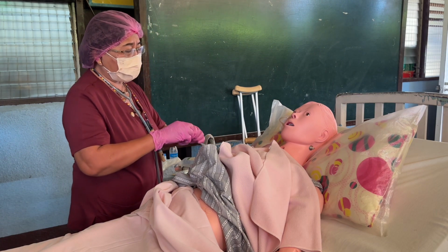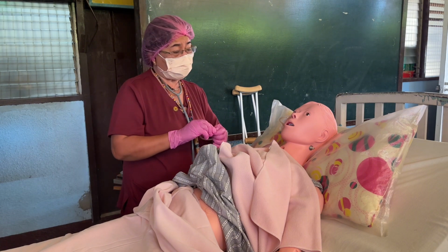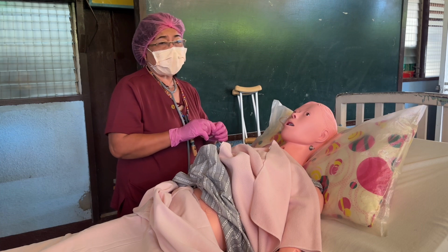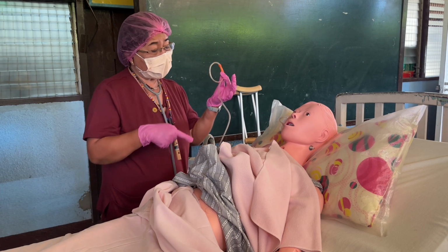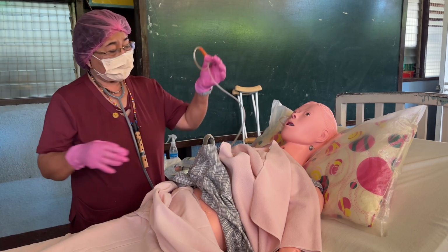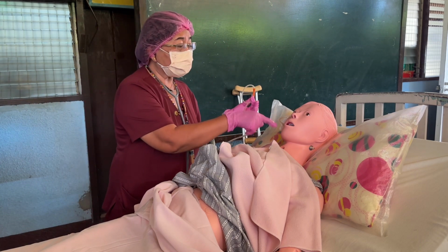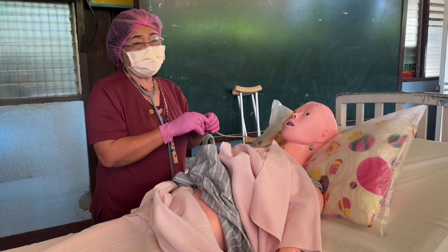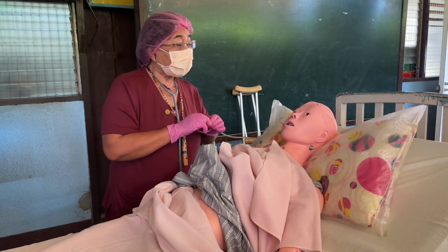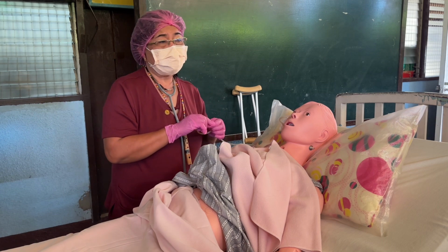And then the fifth way to determine if it's really in the stomach is the length of the tube, if it does not move. I have said that there are lines which indicate how long you're going to insert the tube. So it should be the same until this moment. Okay? So those are the 5 ways to check if the tube is in the stomach.